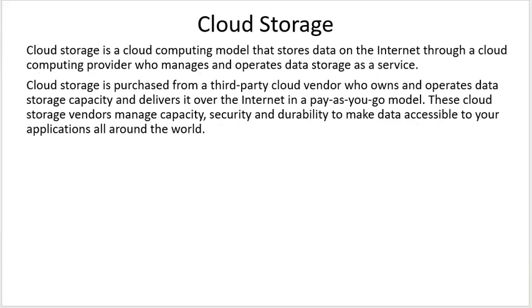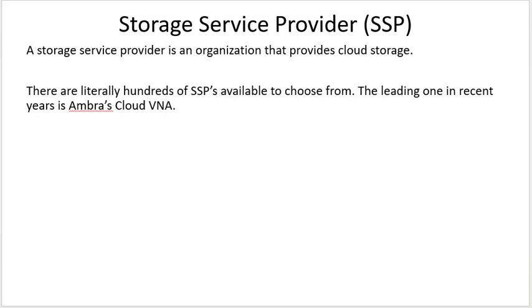Cloud storage is a cloud computing model that stores data on the internet through a cloud computing provider who manages and operates data storage as a service. So this is something you purchase from a third-party vendor, and they handle the data storage capacity for you. If you don't want to maintain the archive, and you also don't want the cost associated with maintaining the archive and adding more storage to it, you can just pay a fee and give this whole problem to a cloud storage computing group. Unfortunately, you don't have any control over the archive if you do that, so that's the trade-off there.